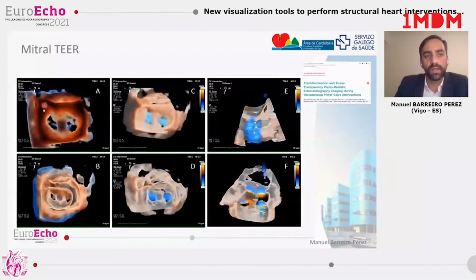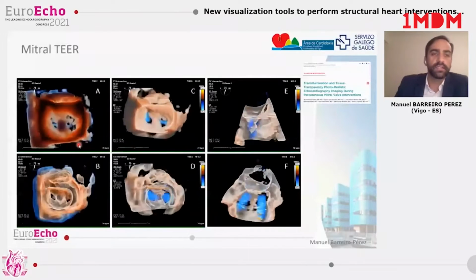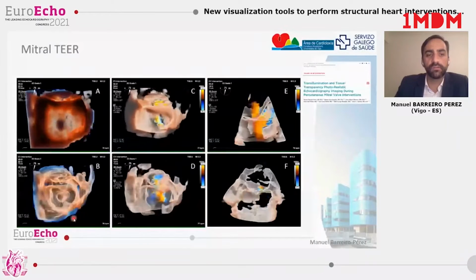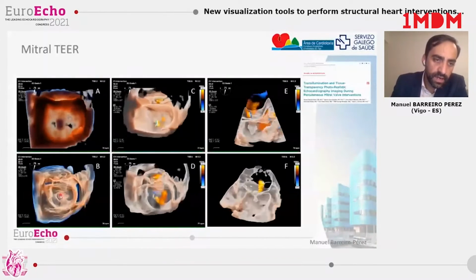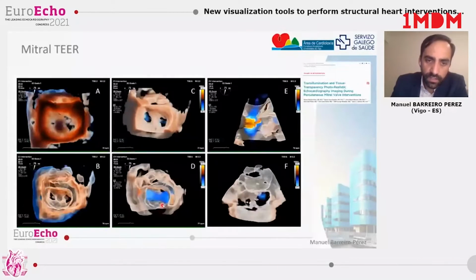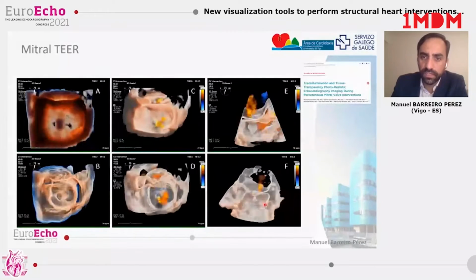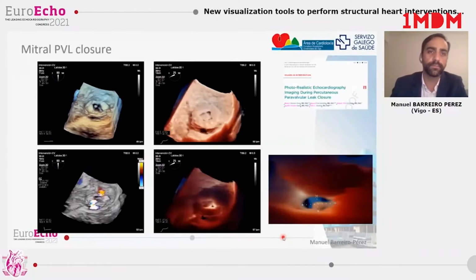For example, for the quality and the grasping properties, transillumination with the true view is more useful, and for studying the anatomy of the new orifice, for example, the glass view. And the glass view, erasing the artifact of the clip, is really useful as well for locating the residual jets, as you could see here, that is, in that case, immediately lateral to the clip.